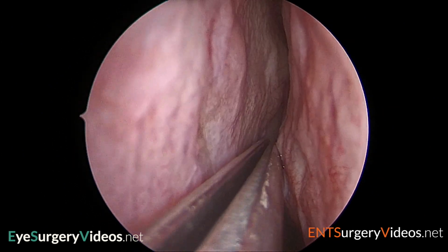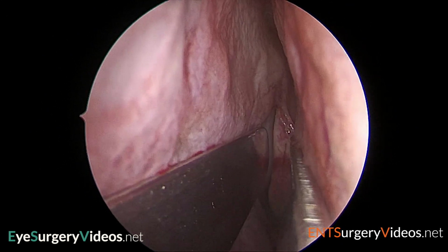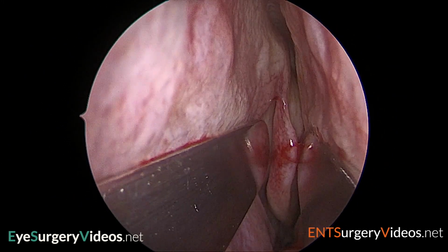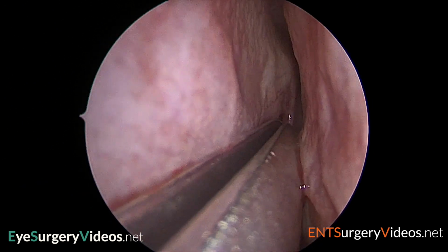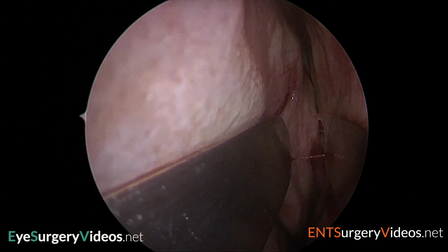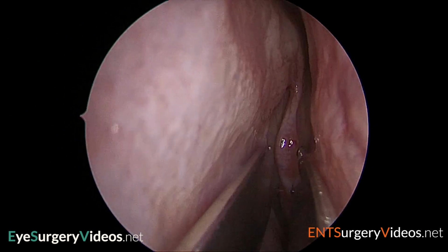The nasal septum can be deviated medially with a flat instrument. A Freer's retractor can be used to move it a little, whilst opening a Killian speculum, as you see here, can move it quite markedly. However, there is a case report of this manoeuvre causing a cribriform plate fracture and CSF leak, so care must be taken.